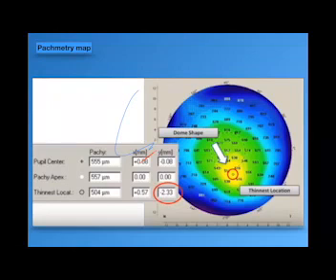Is it better if I have a patient with thin cornea, about 450, and a refractive error, for example, minus 2 diopters in one eye and minus 1.5 diopters in the other eye. The patient needs refractive surgery and wants to remove the glasses. Would you advise him to go for phakic IOL, or to advise him not to do any refractive correction because this refractive error is too small to justify the phakic IOL complications?